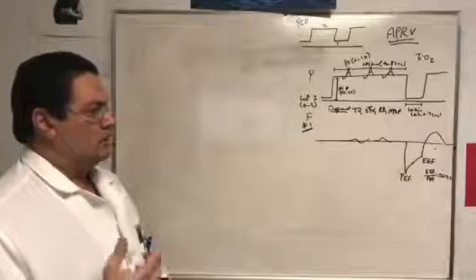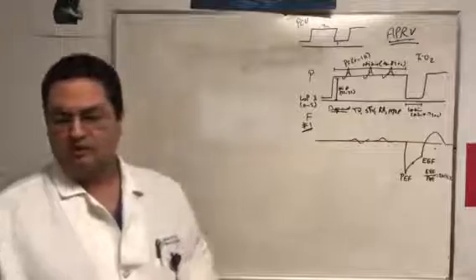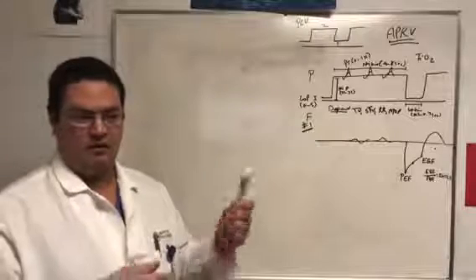Now, when you have somebody on regular vents, at least in this hospital, the respiratory therapist evaluates the vent every 4 hours and PRN.